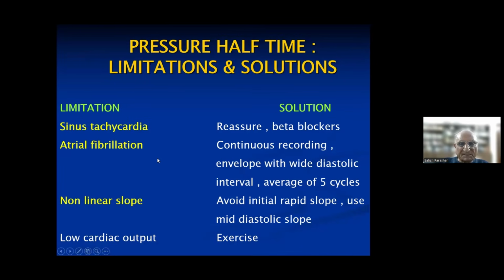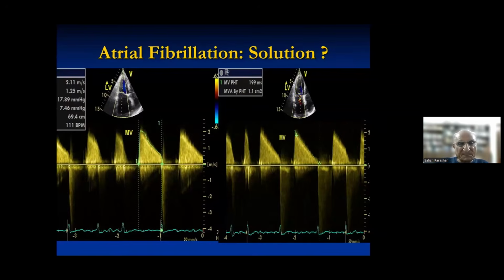The second problem we always face is atrial fibrillation. Atrial fibrillation is very frequently seen as a complication of mitral stenosis. Now, in atrial fibrillation, the heart is moving in very rapid and irregular phases. There may be no A wave, and some slopes are very wide, some are narrow. So you cannot find out anything here. You cannot find anything here.